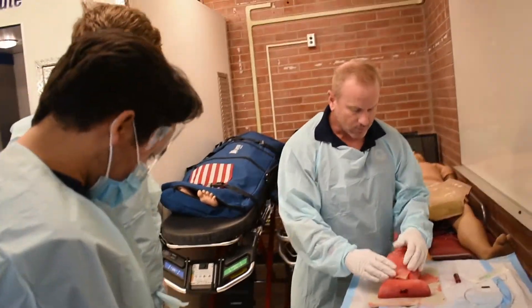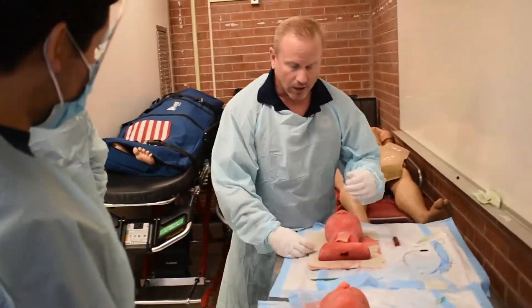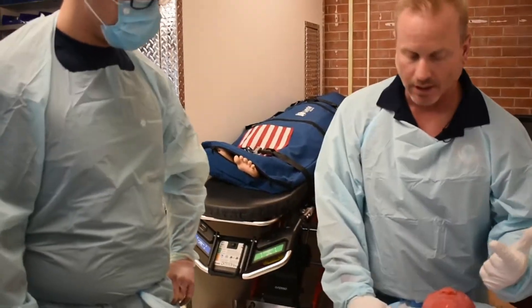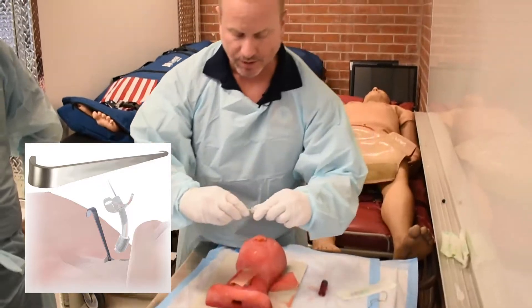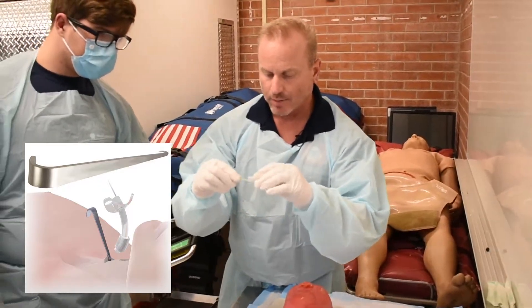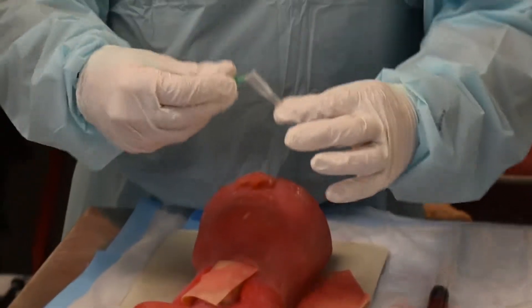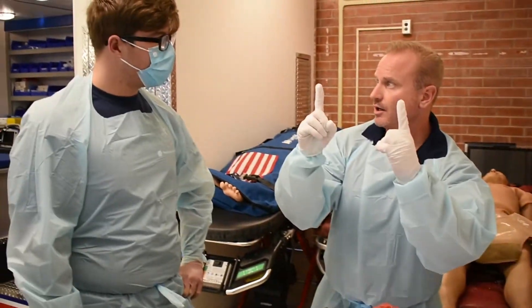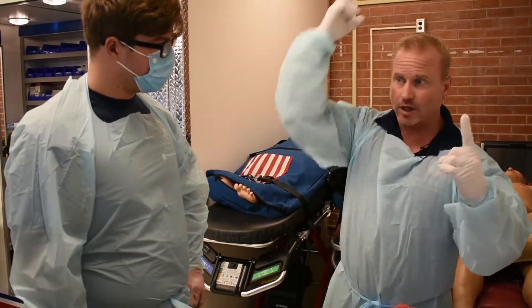What do you need for a crike? You need your scalpel. You need your landmarks, hopefully. A 5.5 or 6.0 ET tube — never bigger than a 6.0 ET tube. If you don't have a trach hook, you can make one by taking an 18-gauge needle, coming halfway out, and just bending it. Now you've got an outstanding trach hook. I carry a bougie with me — a crike bougie — the bougie's only this long. If all you have in your ambulance are those really long bougies, just cut it in half.